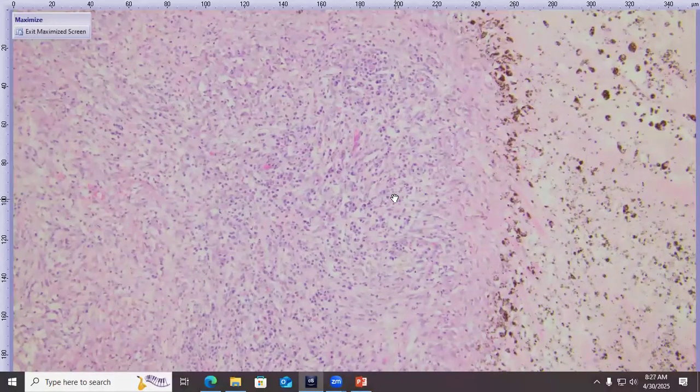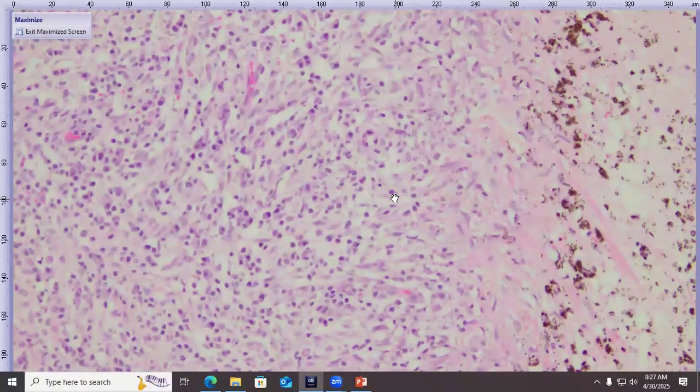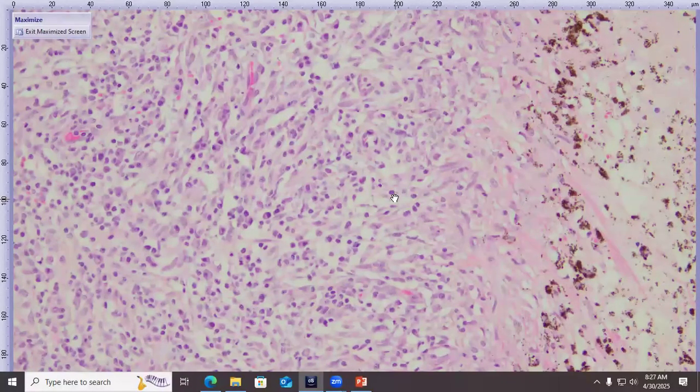So because this case is bilateral and relatively symmetric, they didn't really tell us exactly what the onset was in one eye versus the other. Maybe this isn't as interesting to drop down on, but it's a place to drop down on. So bilaterally symmetric, they didn't really tell us what the onset is in one eye versus the other, but especially if it was basically synchronous, like both eyes presented with similar severity at the same time.